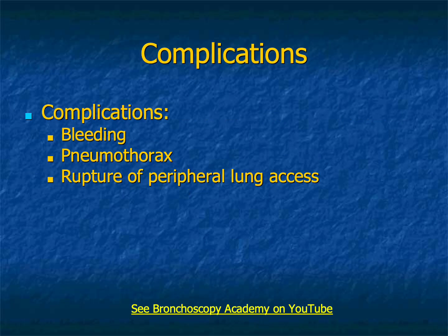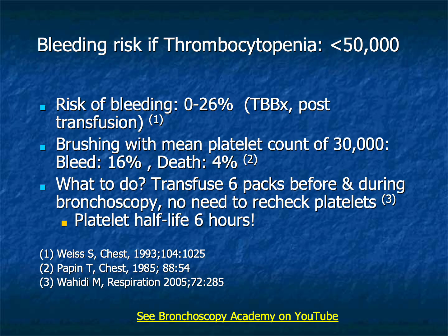Although brushing may seem simple, no procedure is free of risk, and even brushing can induce bleeding, pneumothorax, or peripheral lung injury. These complications are especially important in thrombocytopenic patients. Older studies remind us that bleeding risk increases substantially as platelet counts decline. Severe thrombocytopenia may transform an apparently routine procedure into a high-risk intervention.